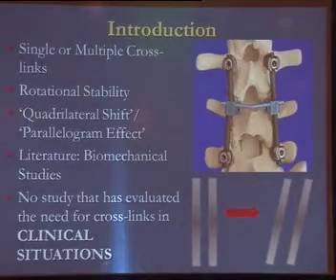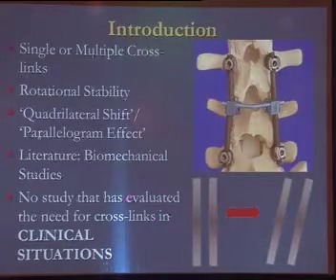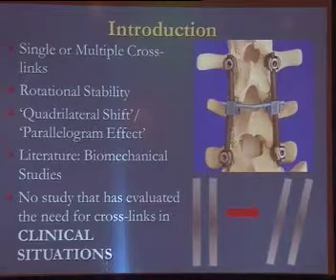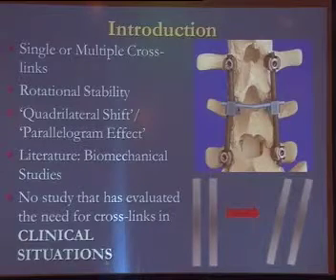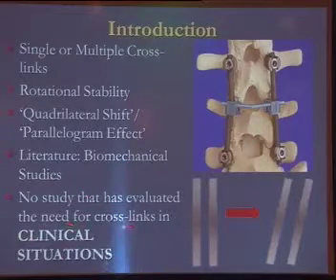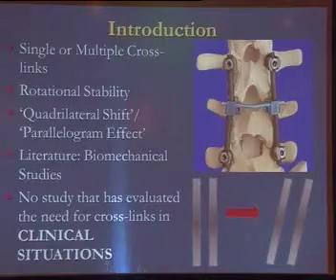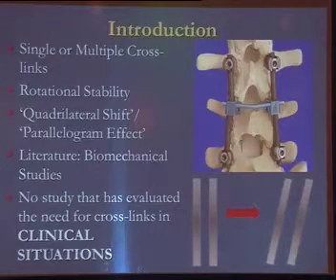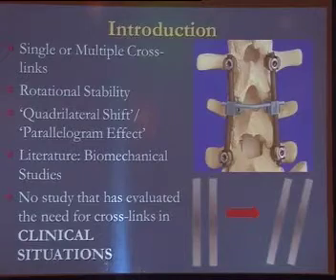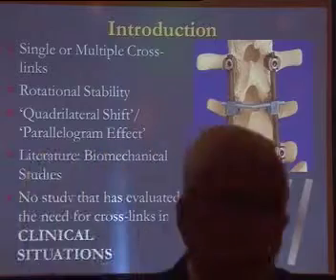There have been innumerable biomechanical studies which either supported or refuted the use of crosslinks, that is transverse connectors, in our practice. But there has not been a single study that has evaluated the need for crosslinks in clinical situations. In clinical situations, there are a lot of questions whether to use crosslinks or not, if at all we use, whether to use single or multiple, and if at all we use, where do we put the crosslink, either at the top end, at the center, or at the lower terminal portion.